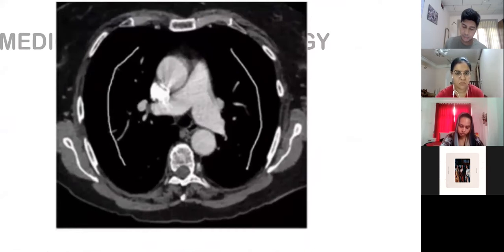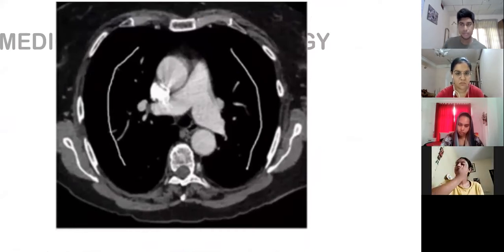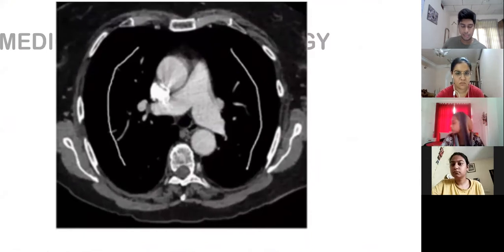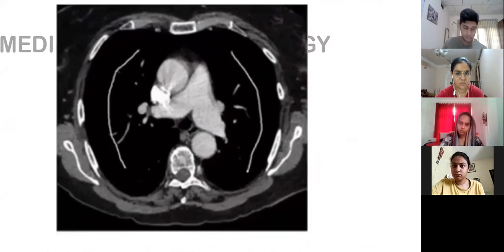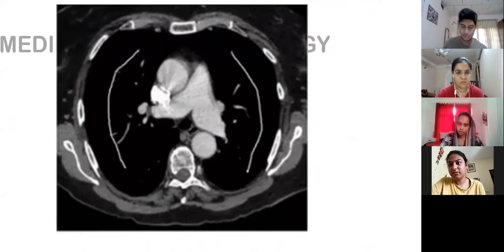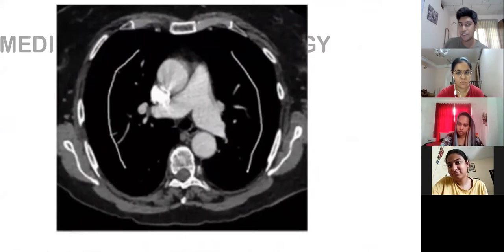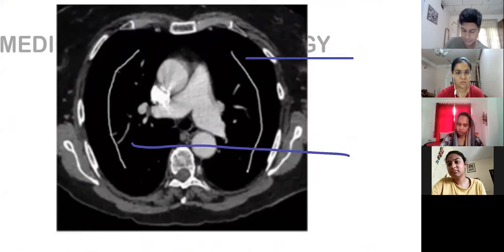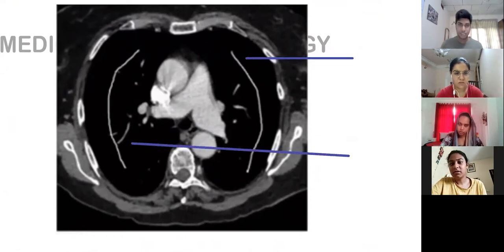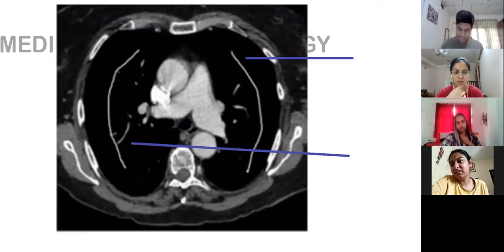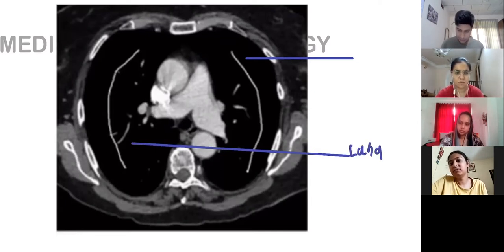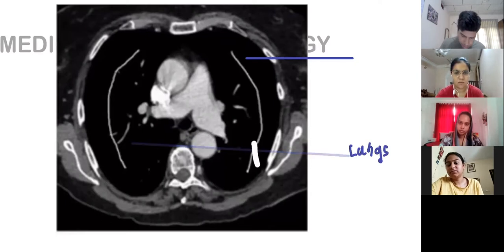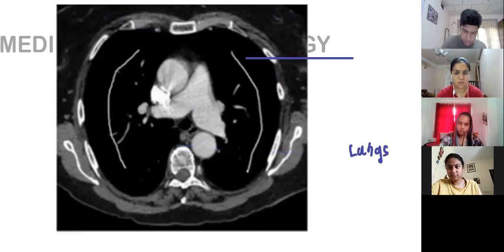Today let's discuss one more thing. Can someone tell me where this image is from? Which region of the body? We are not going down now, we are going up. Look at these blacks - yes, these are the lungs.